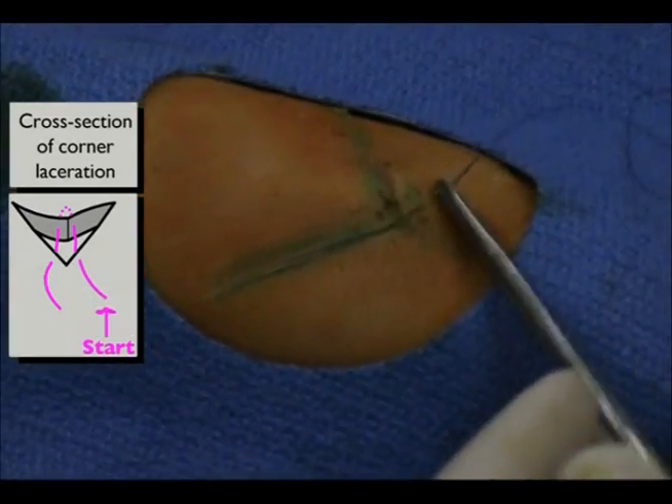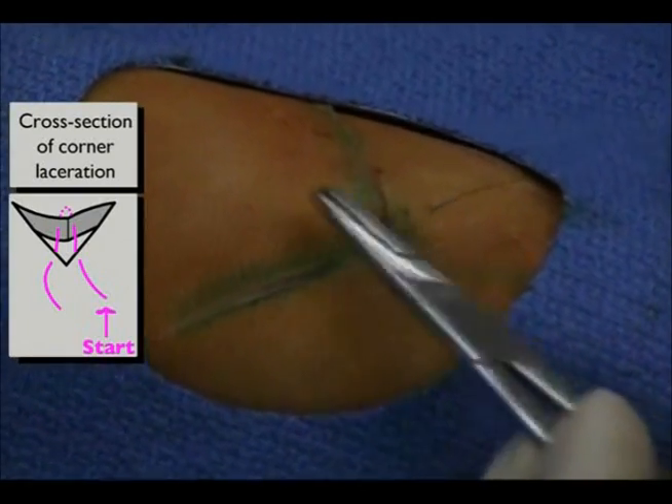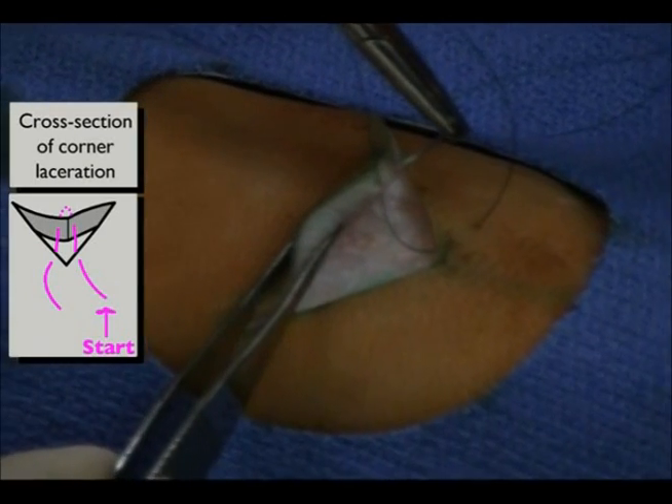First, insert the suture along the non-flap wound edge, aiming towards the triangular flap exit in the subcutaneous layer. Then reload the needle on the driver.